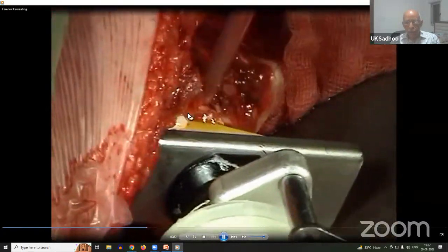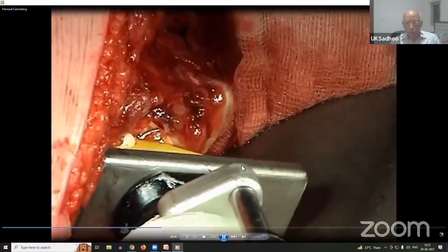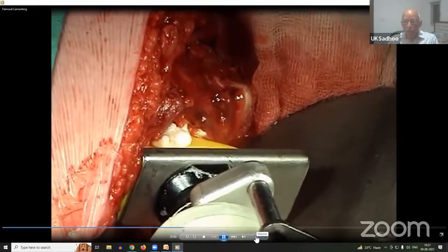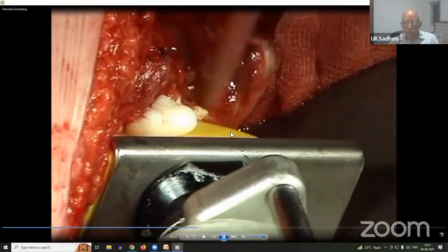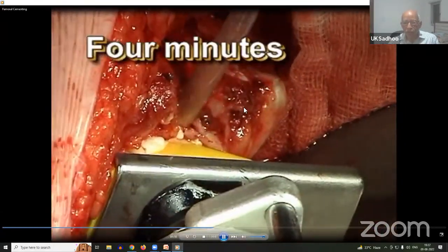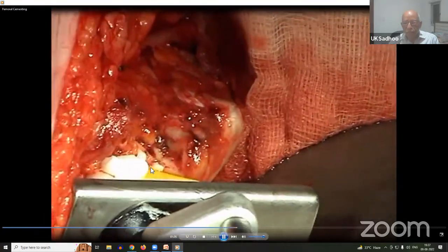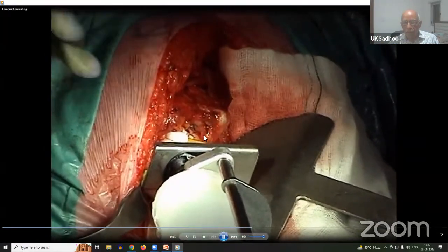So it has this rhomboid sort of seal, which has a metal plate, and this rod has a pusher, which with all might of his body, the surgeon is pushing, and you can see this, despite a good seal, the cement is still escaping. What is more important is to see this, the medullary contents escaping from the neck. Such is the pressurization that the marrow is escaping from the bone.